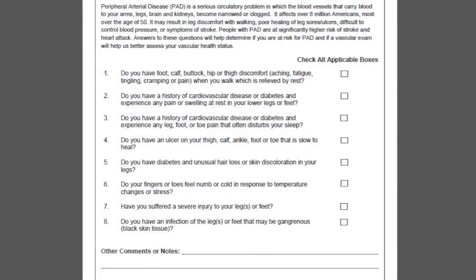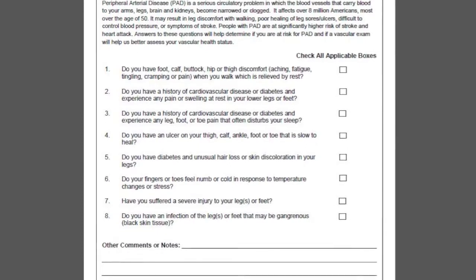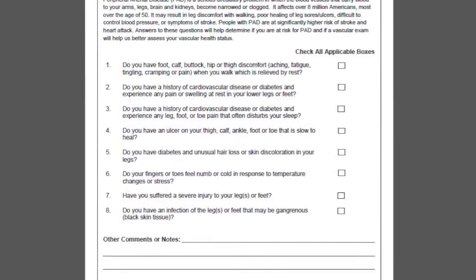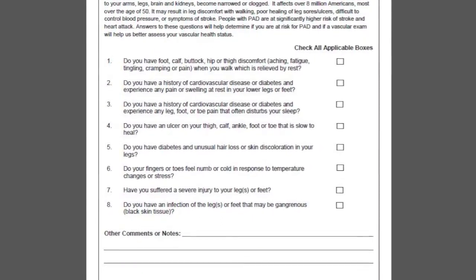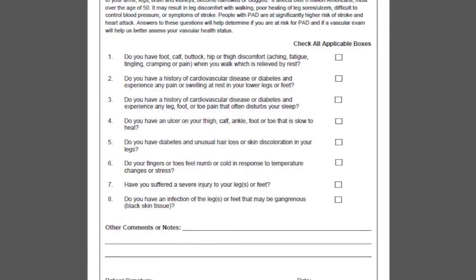The physician can review this questionnaire along with the patient's background and risk factors in order to assess if non-invasive testing is necessary. If indicated, only those patients whose history and physical examination results show appropriate symptoms that indicate medical need for the test should be tested. Be sure to ask the patient if they have any condition that would prevent you from taking a blood pressure measurement on their arms or legs.